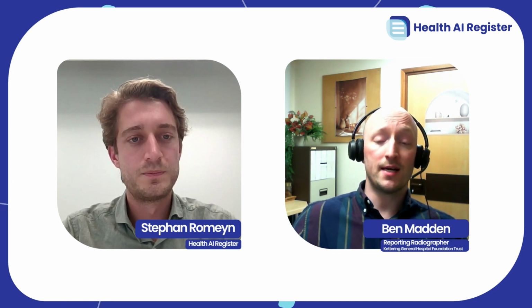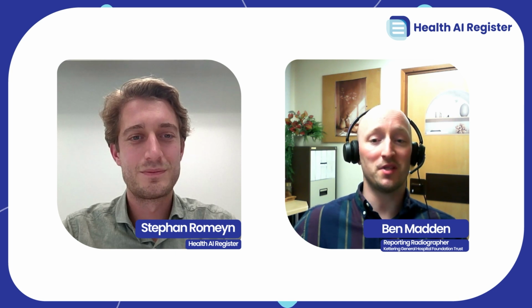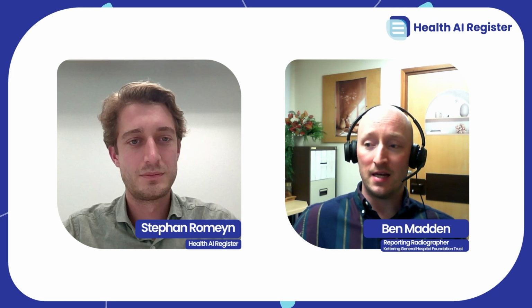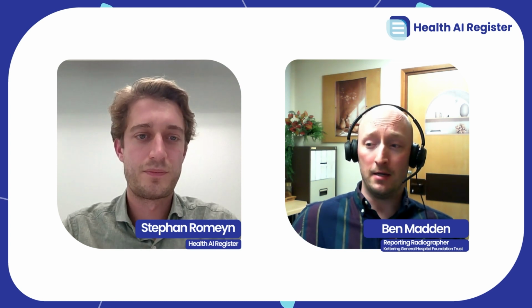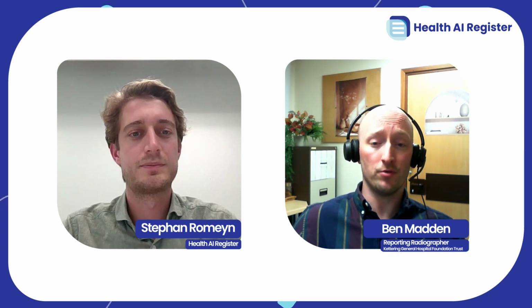There were a few trusts that already had RB on board. We got good feedback from that. Also, when you're Googling and trying to find all these different systems, RB was always top of the list. So in discussions with RB and a few others, it was the feeling they gave us and the turnaround in questions they gave us, the speed at which they go back to us, the feeling of there's no sell pressure. It was very much a conversation about how we could implement this, and they were very, very good about funding a trial with us to have a look and prove its accuracy.